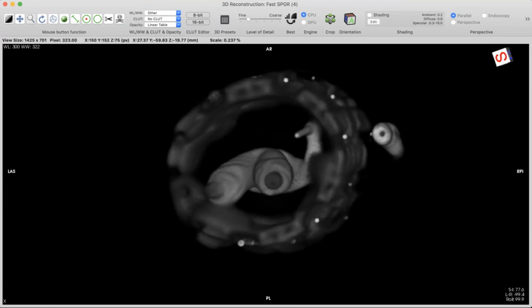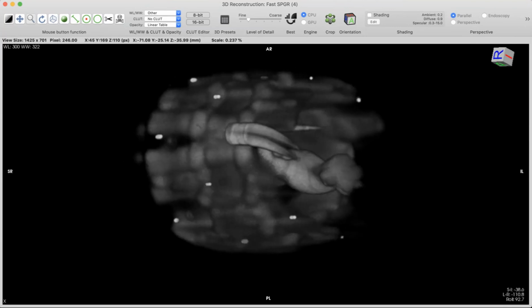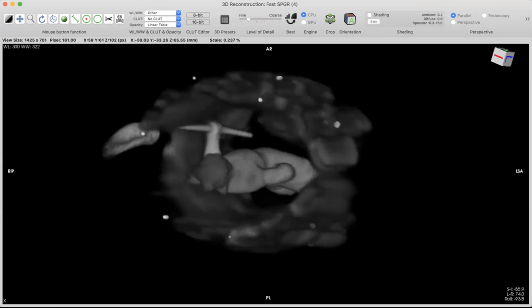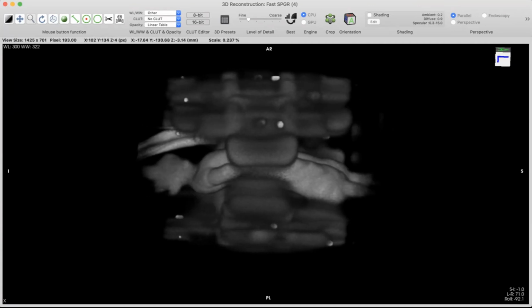Yeah, that's right. Usually the coil is also made out of plastic, and I think it's also ABS. It has a very short echo time, so it's not a problem. But when you use ZTE, you're actually receiving signal from the housing of the coil itself. So here you see the plastic of the coil. And some of the bright stuff, it might be some softer plastic. Softer plastic will have a slightly longer T2.